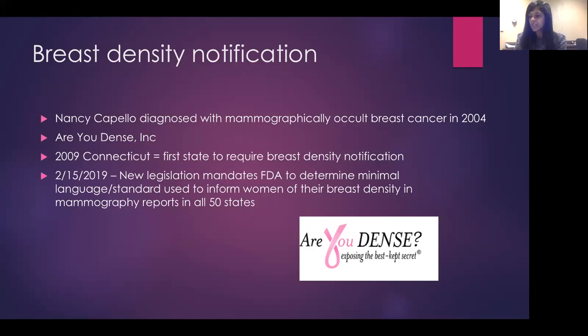So in 2004, she had a normal mammogram, and about 6 weeks later, she had a physical exam, and her physician felt a palpable ridge. So she was sent back for additional imaging. She had a repeat mammogram, which again was negative, but she had an ultrasound showing what proved to be a breast cancer, which was metastatic to a lymph node.